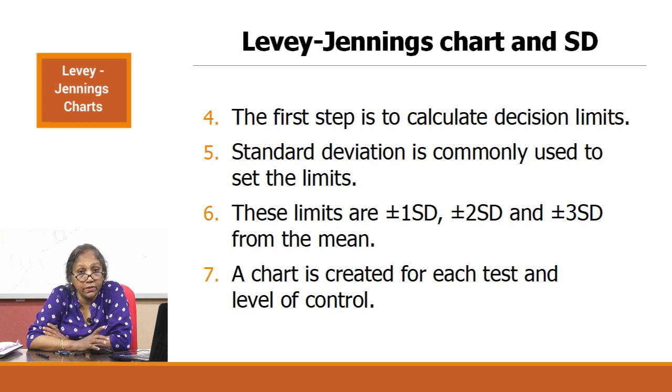When you set the limits, this also we talked about in the previous video, the limits that you would set are plus and minus 1 SD, 2 SD and 3 SD from the mean, and this chart is created for each level and each control. So there's one little point that I would like to bring out when we are talking about the 1 SD, 2 SD, 3 SD limits.